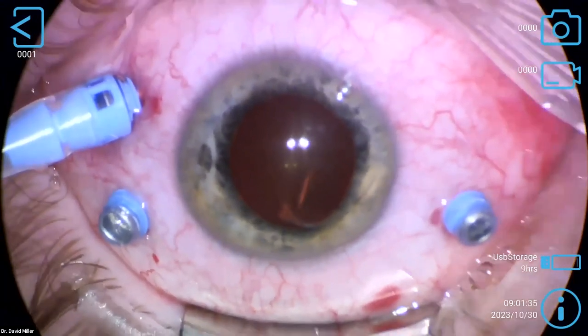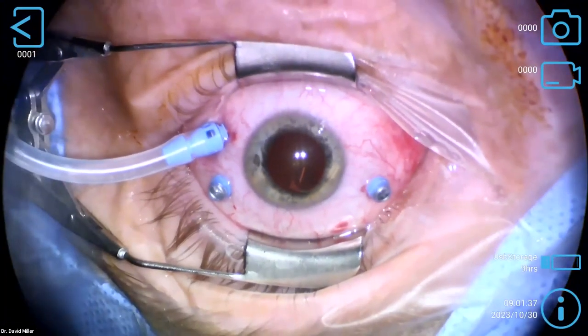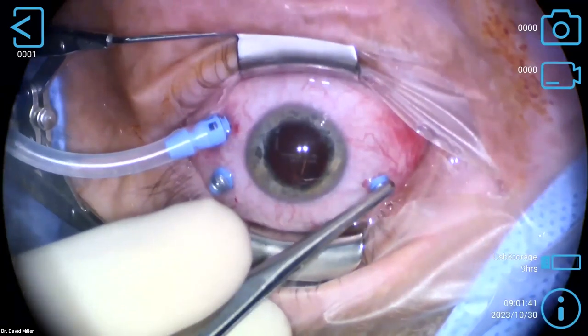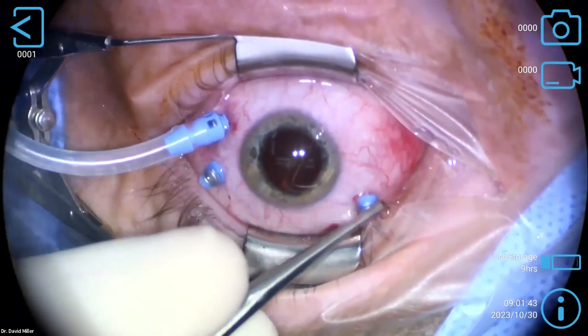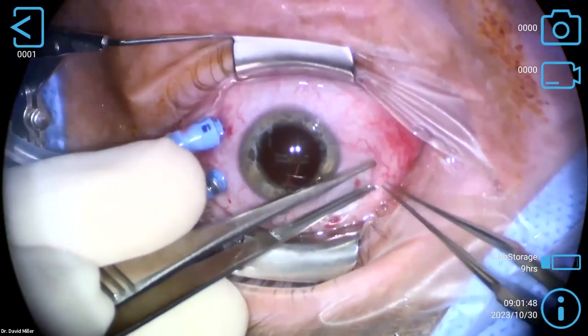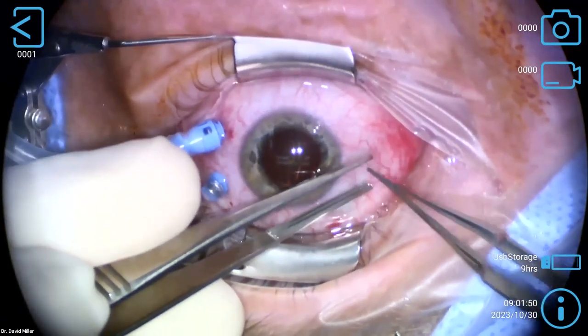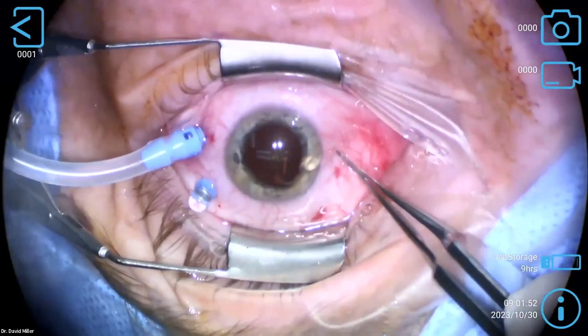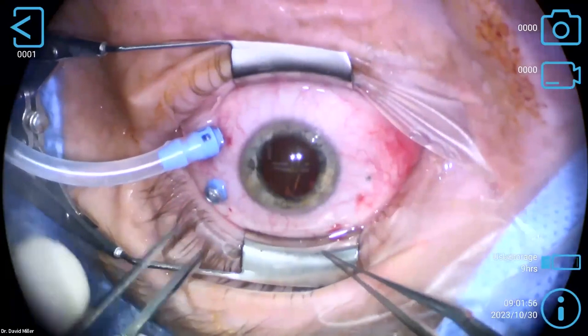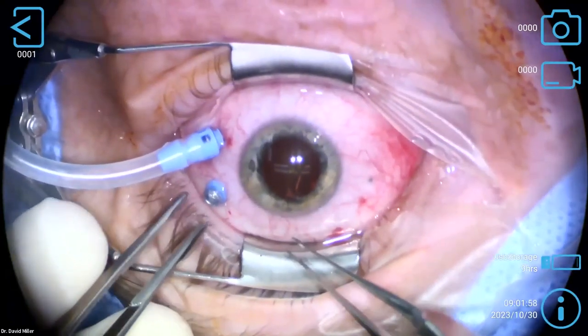So what we're going to do here is, while we're getting him patched up and the room turned over, I'm going to get a 0.12 there. Let me just show him this. I'm going to pull this out, by the way, and we may not get to see this later. So you can see right here where that wound was at. If you press, these wounds are angled. If you press on the top of that wound, not in the wound, but on the top, it kind of collapses that tunnel. I'll try and show you over here.